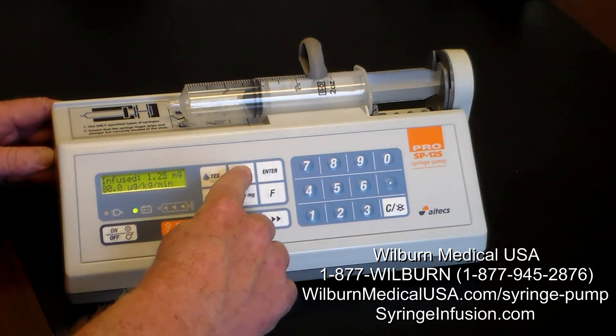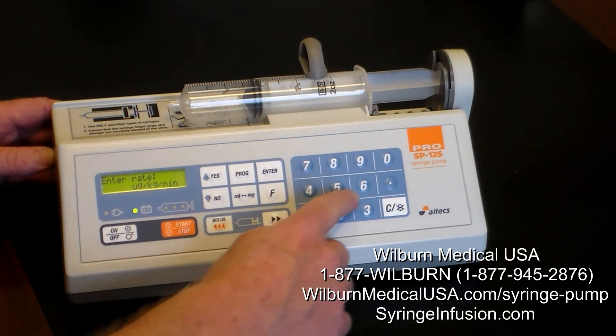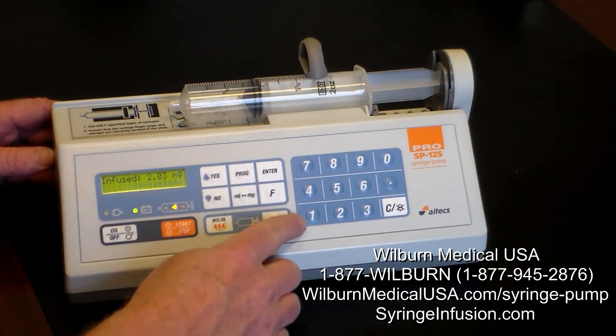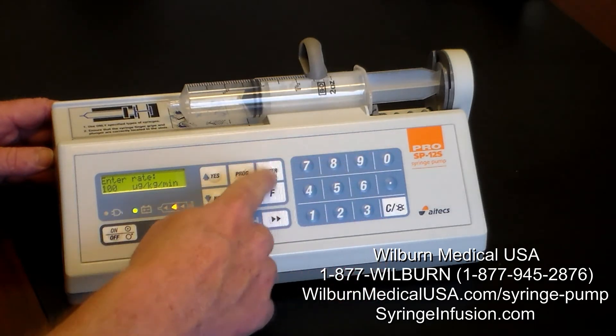To change the rate while it's running — currently at 80 — if I want to make it 60, or if I want to increase it to 100, I simply enter the new value and press enter.